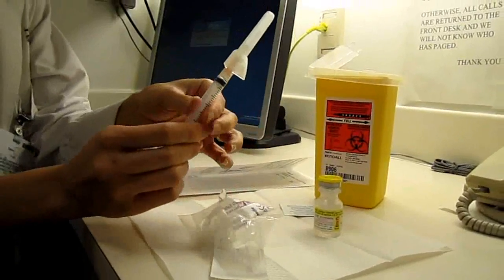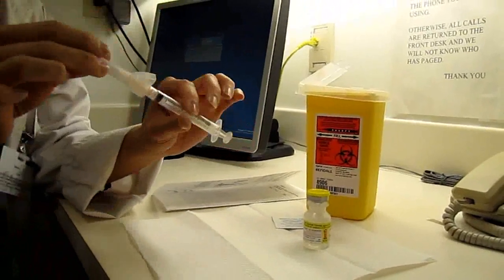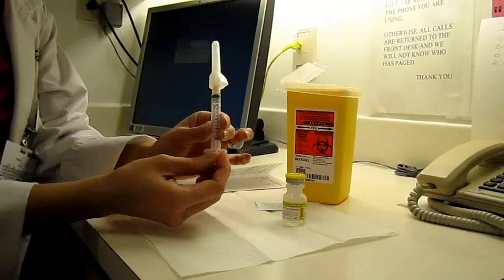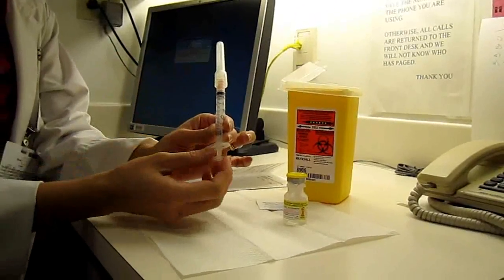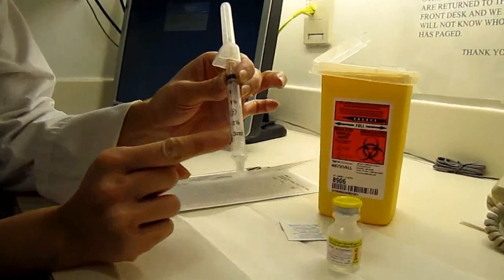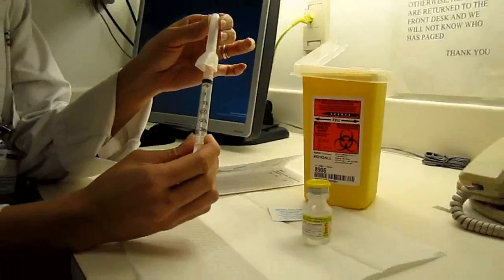Depending on where you get your supplies from and what pharmacy you get your supplies from, your needle and your syringe may look slightly different but generally this is what you'll see. Some will be a screw-on top, some will be a slip-on top. This one is a luer lock attachment. Today for demonstration I am going to be using a 3cc or 3ml syringe. That is your prepared needle.